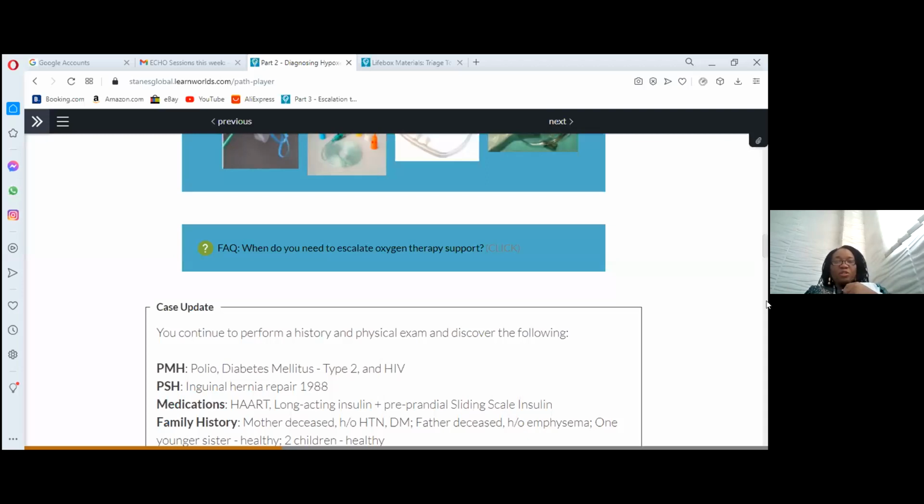It would be quite difficult to get, but usually in our clinical practice, and based on the previous question on the devices and the flow, the FiO2s are achievable, and based on the responses on when you escalate. First of all, the pulse oximeter tells us how much oxygenation the patient is at that point in time, and we want a saturation above 94.